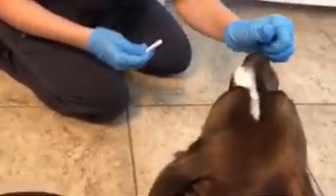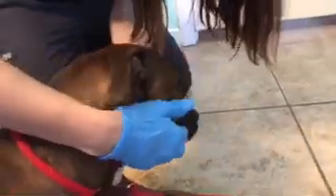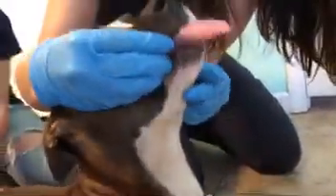So here's another one I'm going to do. And you can massage the cheeks. He's very distracted, but this is actually very typical. This is what I'd expect, so it's good that you're seeing it now. And as always, it's more attention the dog's getting, so ideally you'll have your hair pulled back for this as well.